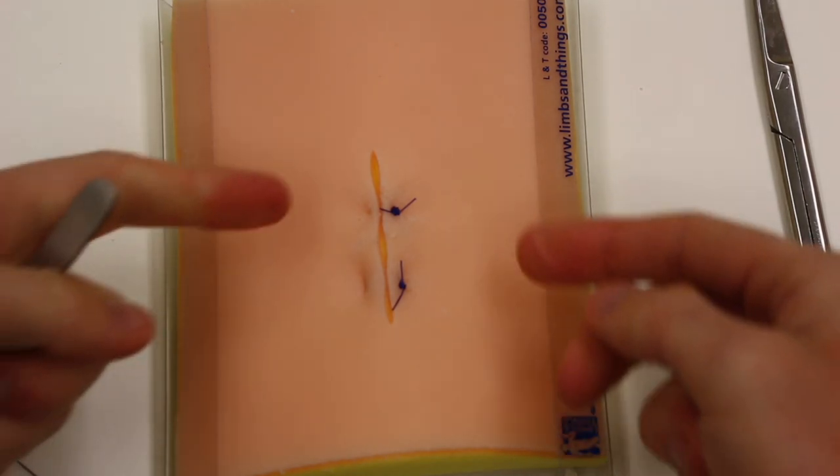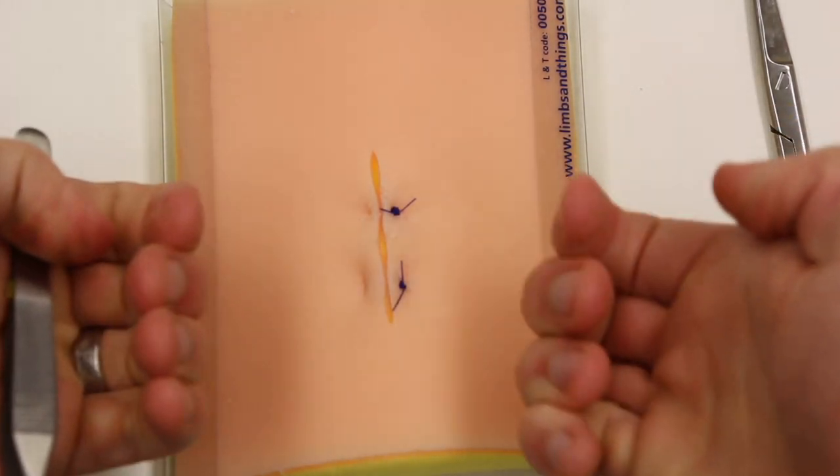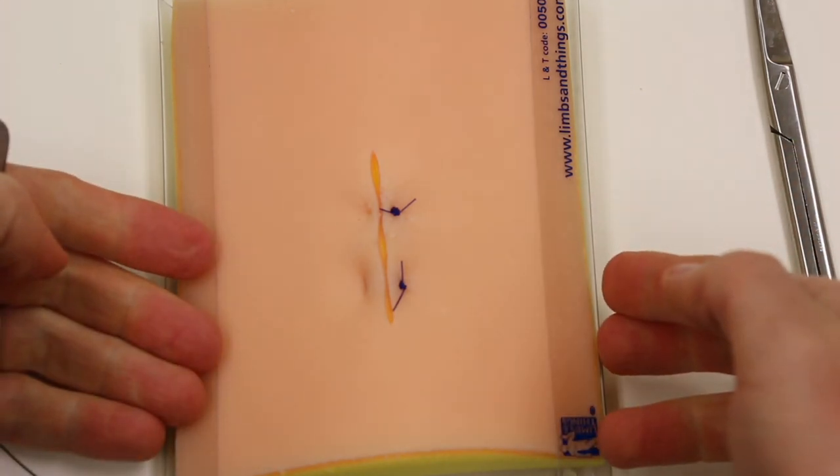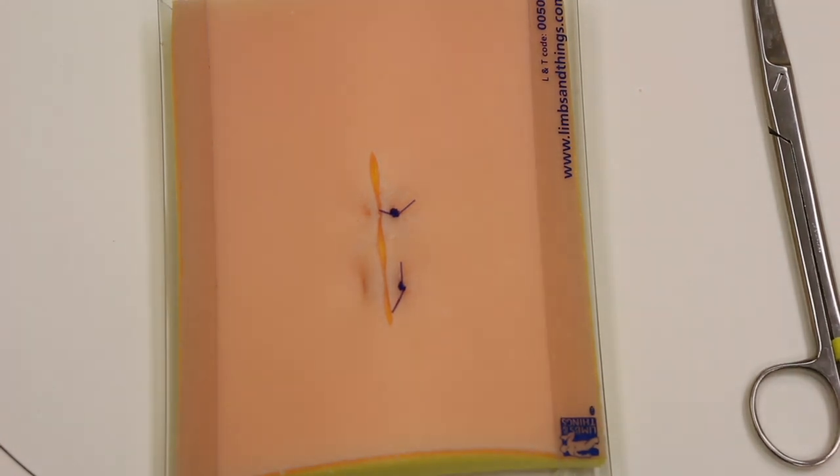So both suture kinds, both the vertical and the horizontal, gives you strong skin eversion, strong resistance to tension. And both are useful in those cases like fasciotomy closure, where you need to be able to handle that tension.